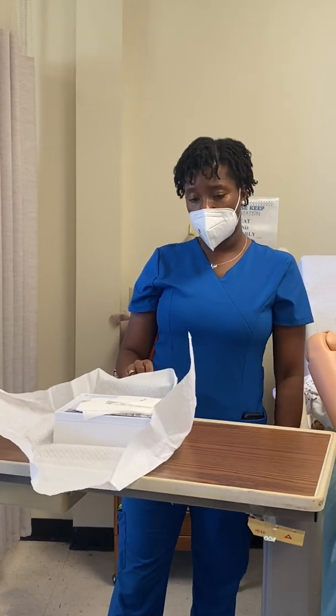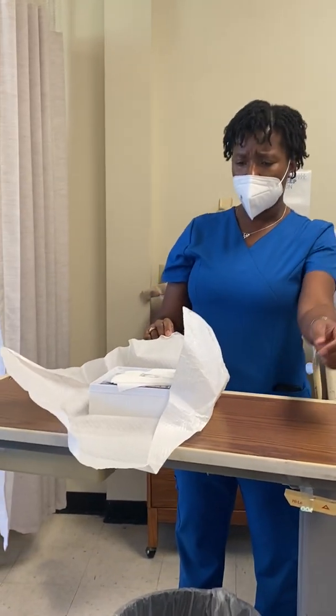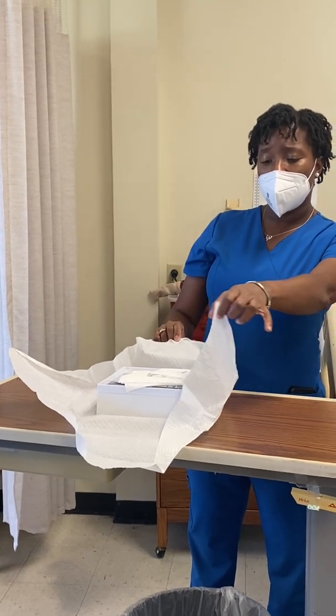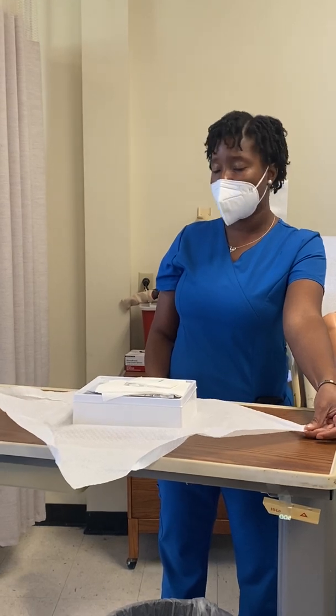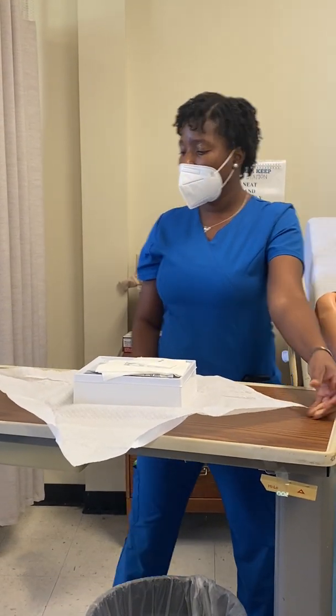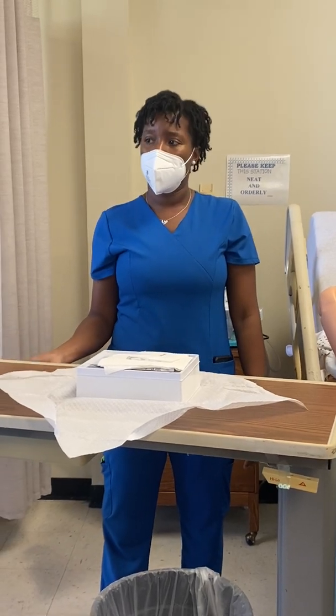Remember, none of this is sterile. So you see how that's trying to flap back on me? And I really don't want it to. So I can grab it at that 1-inch border and pull down. I'm still within that 1-inch border. And you see how it's staying down now? And even over here, I like to do that because I know it's relaxed. Does everybody understand that?